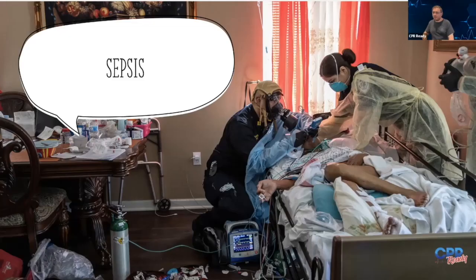All right, let's talk about sepsis. I've got a couple of interesting case uses for capnography now that we have a general idea of just what the waveforms mean. Sepsis is one of my favorite uses for capnography.